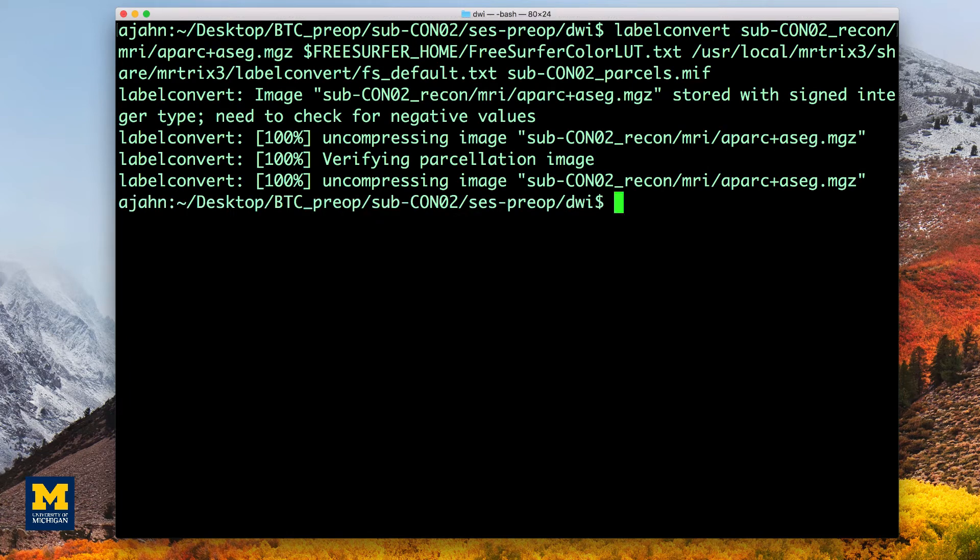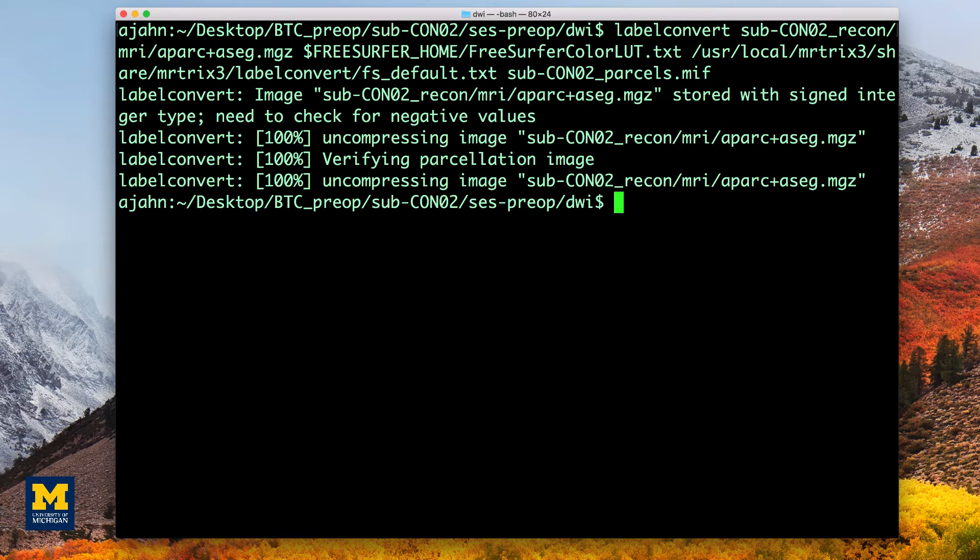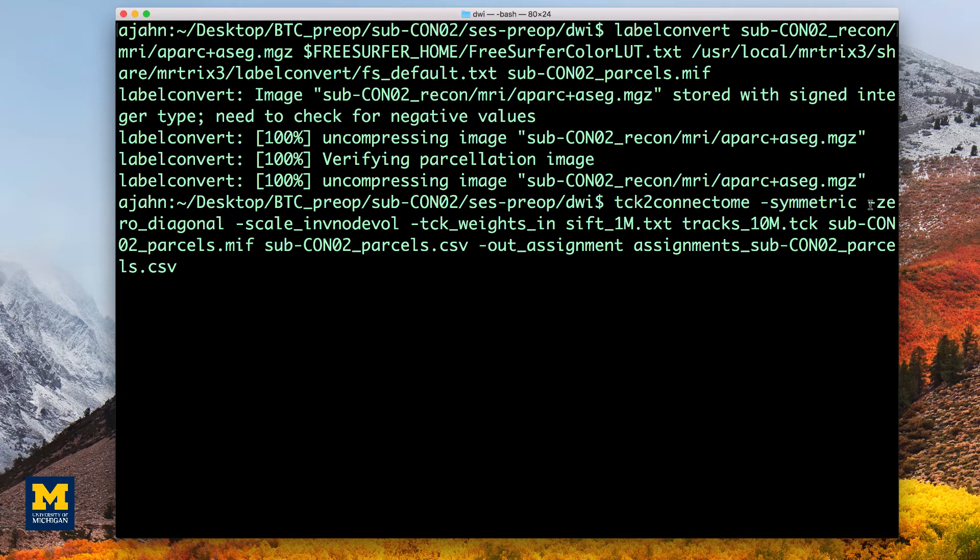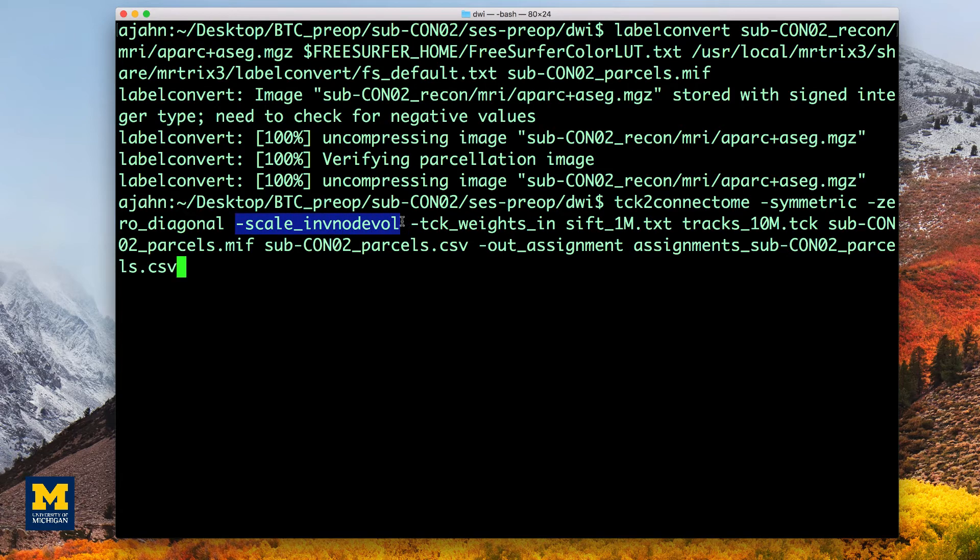We then need to create a whole brain connectome representing the streamlines between each pair of parcellations in the atlas. In this case, it will be 84 by 84 nodes. The symmetric option will make the lower diagonal the same as the upper diagonal, and the scale_invnodevol option will scale the connectome by the inverse of the size of each node.